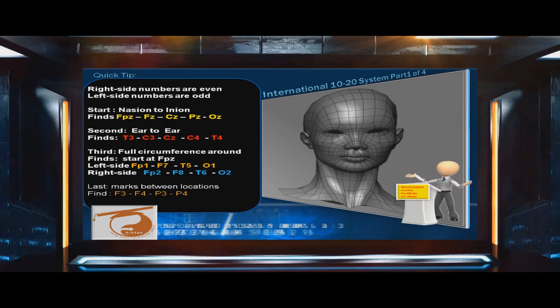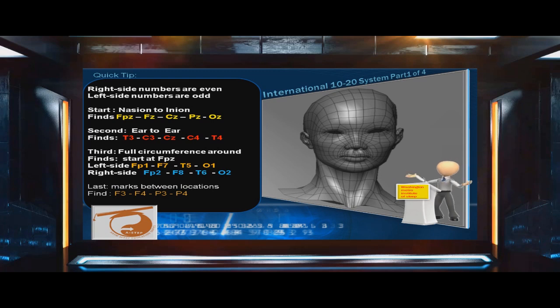First, measure from the nasion to the inion. This will help you find locations FPZ, FZ, CZ, PZ, and OZ.